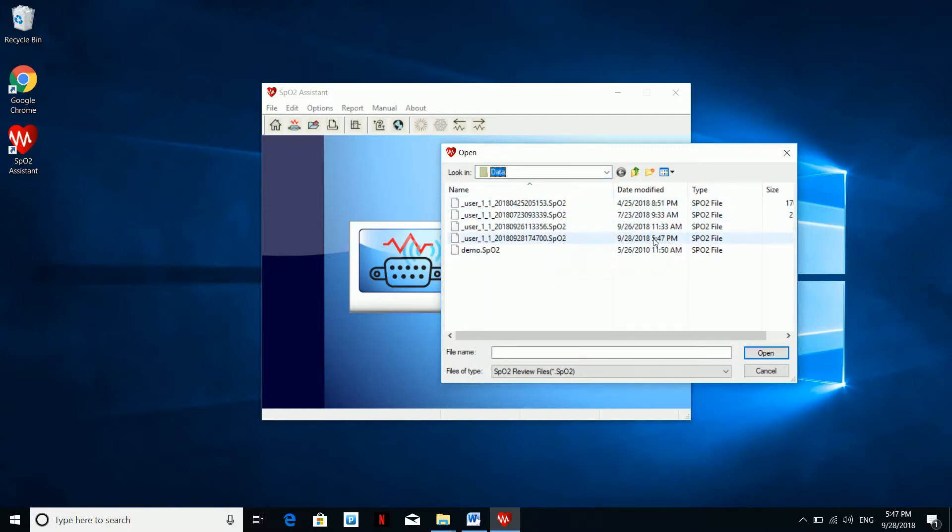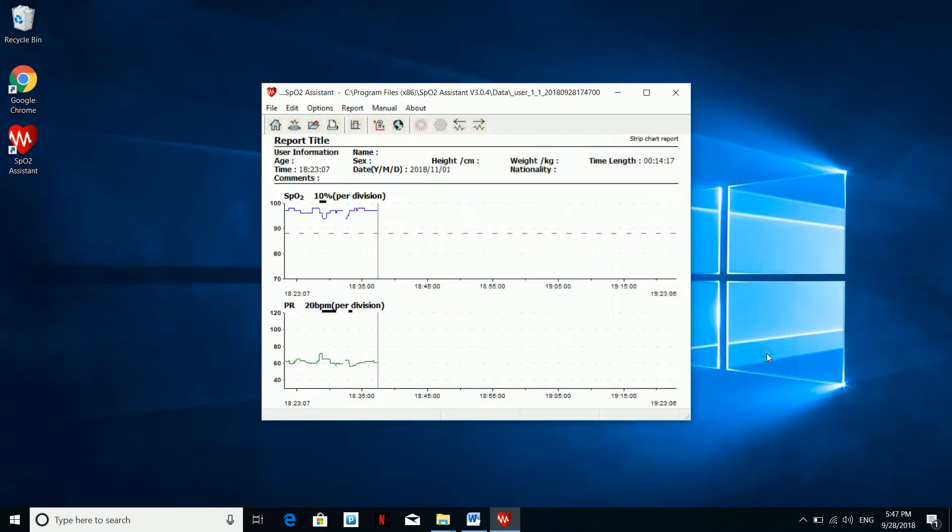Note, these files are recognizable by the software. Select the file you have just downloaded. You can find that out by checking the date and the time. Hit open.